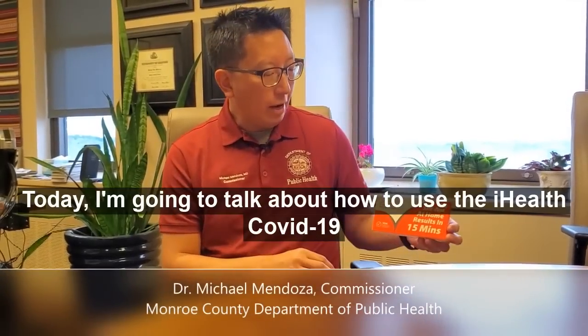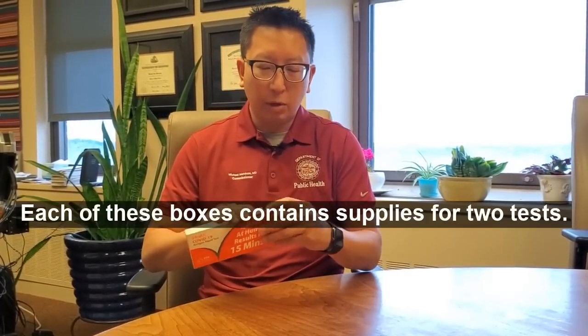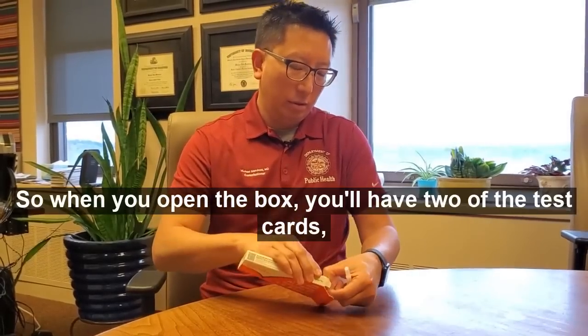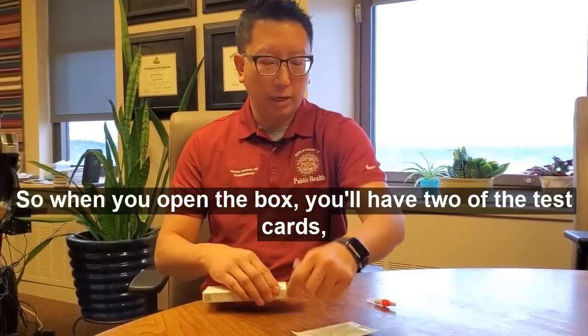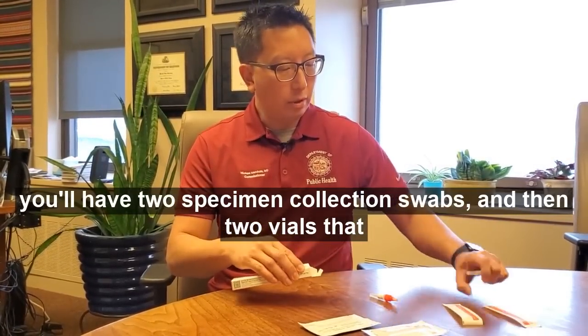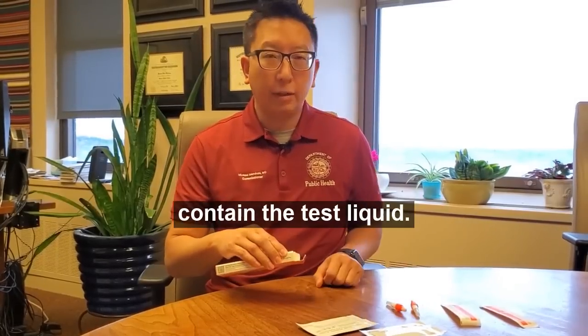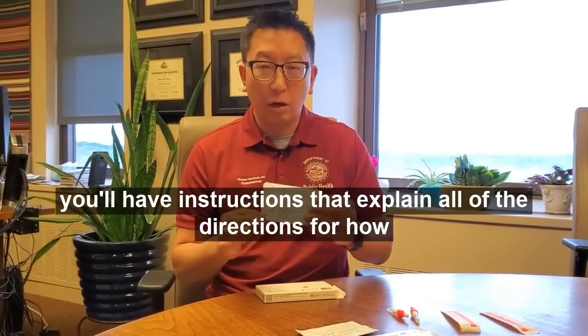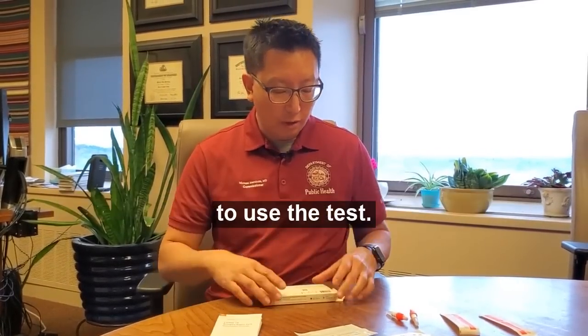Today I'm going to talk about how to use the iHealth COVID-19 rapid antigen tests. Each of these boxes contains supplies for two tests. When you open the box, you'll have two test cards, two specimen collection swabs, and two vials that contain the test liquid. In addition, you'll have instructions that explain all of the directions for how to use the test.